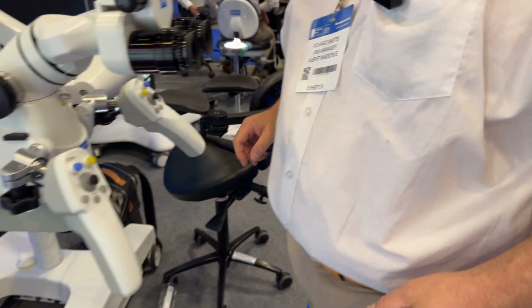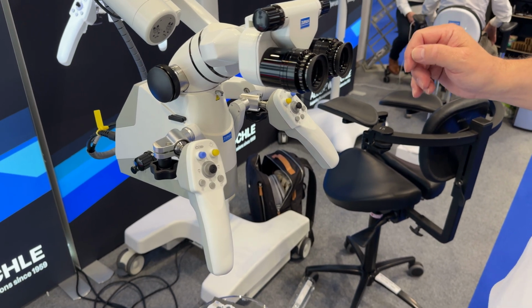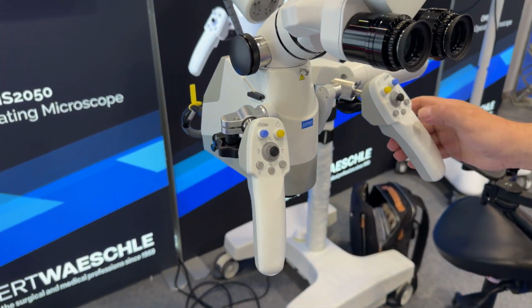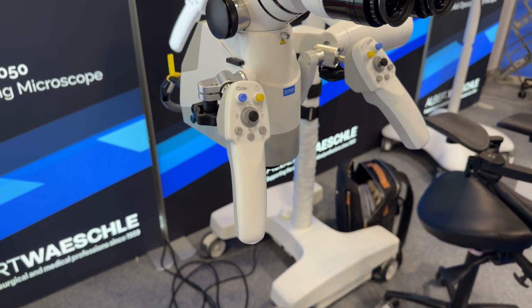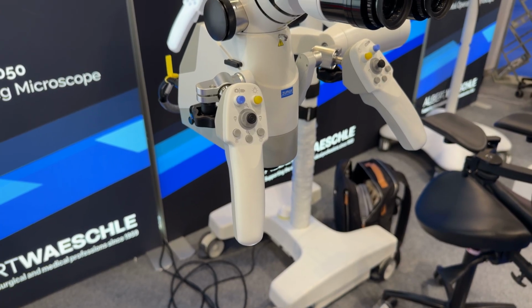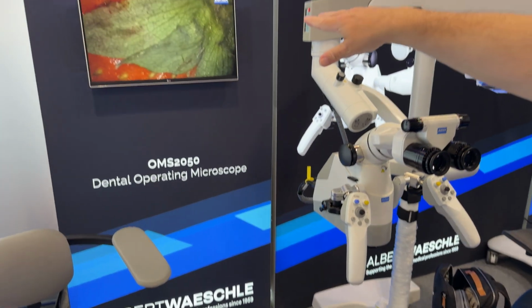Does it have automatic focus? Some of these models do have an automatic focus. On the ones where you've got the automatic focus, if it was out of focus there, you just press that button here, and can you see on the screen? It'll go out and come back in again, and it'll get the focus on the object that's in the centre of the screen.